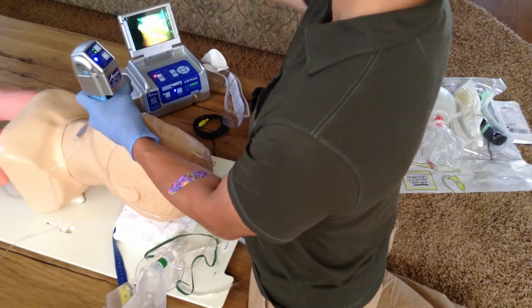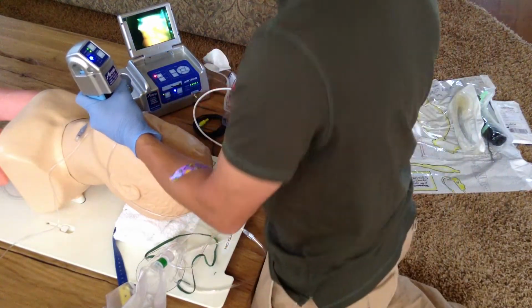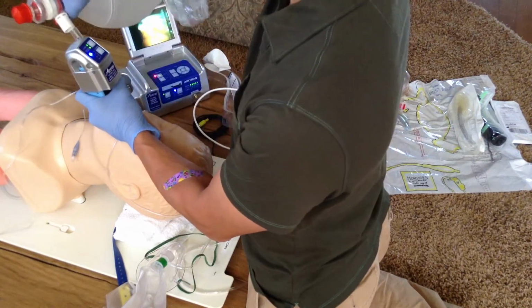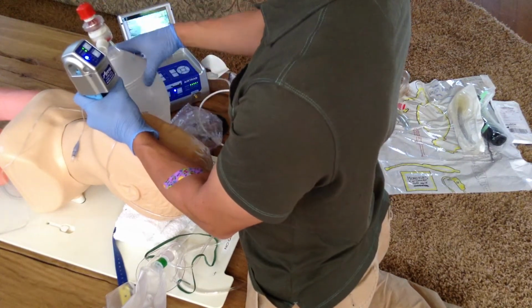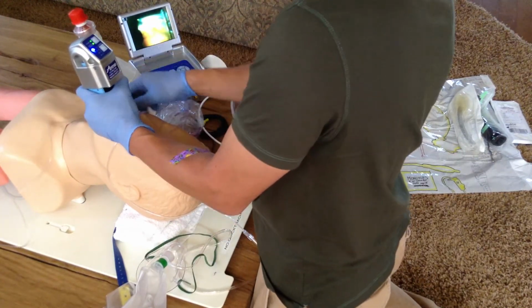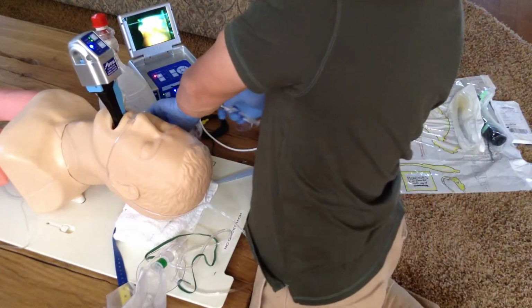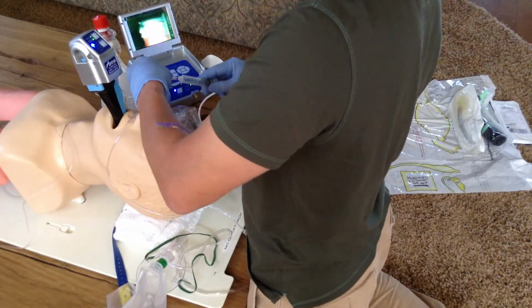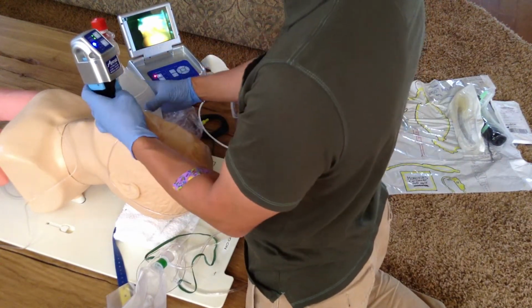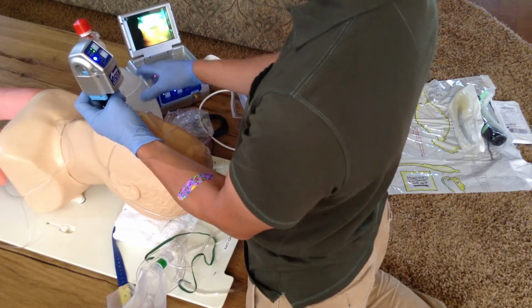So once it's on, we're actually ready to go ahead and put our end-tidal CO2 on. Our partner would help us with that, and ventilate, as well as get our syringe up. And then we can confirm end-tidal CO2 is good. Confirm once more that we're in a good place.